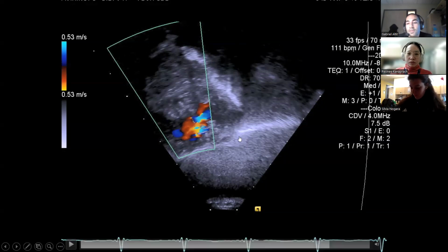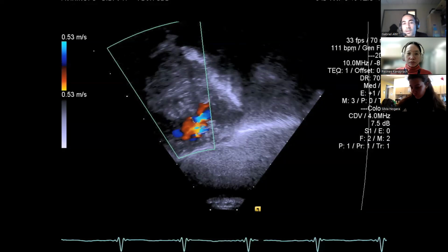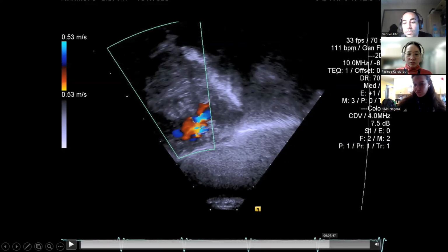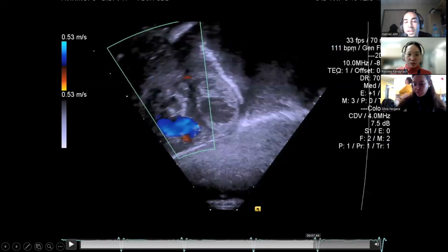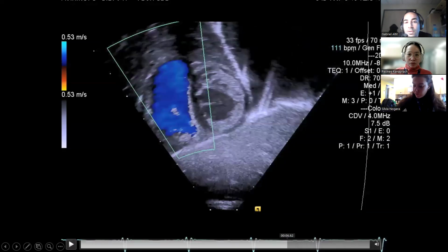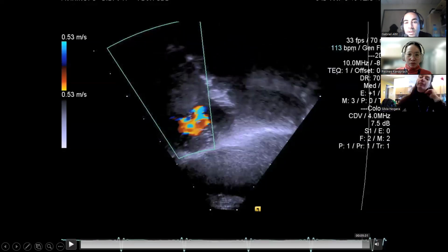And also if this patient has a murmur, that's the reason for the murmur. It's going to be a systolic murmur because it's very restrictive, so it creates turbulence and acoustic findings. And the last thing is that this patient needs a follow-up to make sure it closes in due time. Okay, so you can see it, and you can see how anterior you have to go. This is a very anterior, cross-sectional view.